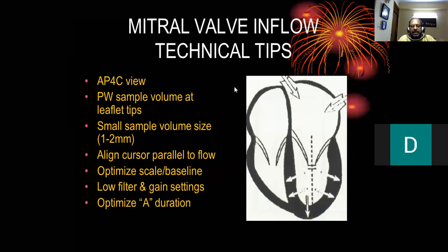So this is a technique. How do we do it? And I'll show you, because I'm thinking of changing my way of presentation to spend time on how to do it. Apical 4-chamber view, pulse wave sample at the tip of the mitral valve.